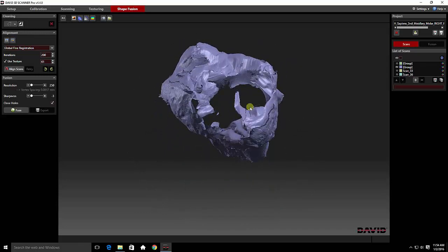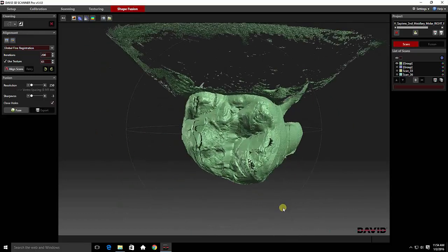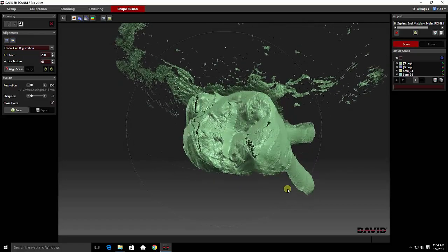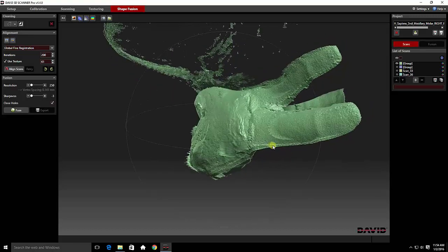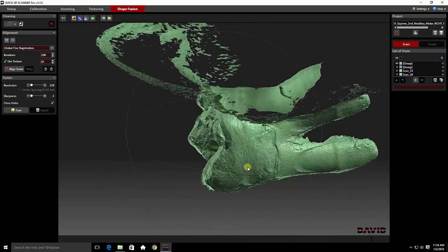We still have some unusual images up here, and we're going to leave those so the computer has something to key to as we put the cap on the tooth. Here's the top of our tooth, and we're going to clean this up. This can be done fairly quickly because we don't need a lot of the sides — those are all redundant information.